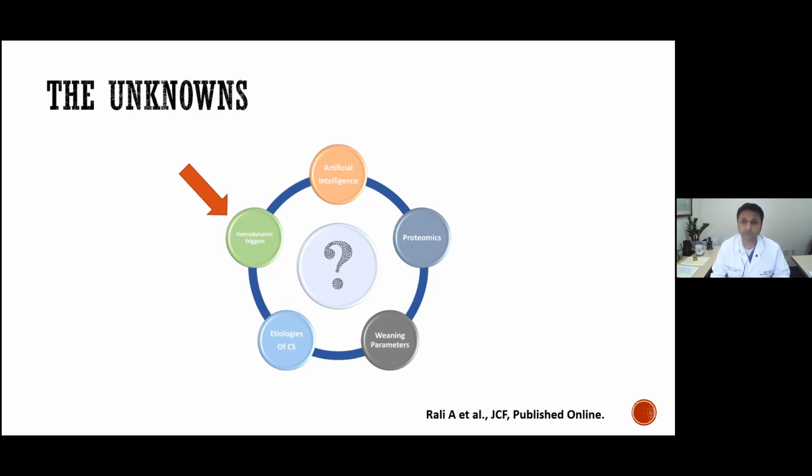We all know that acute MI cardiogenic shock is a completely different entity as compared to decompensated heart failure, as compared to myocarditis leading to cardiogenic shock and requiring VA ECMO. And ultimately, are there certain hemodynamic variables that should then prompt us to deploy LV venting?